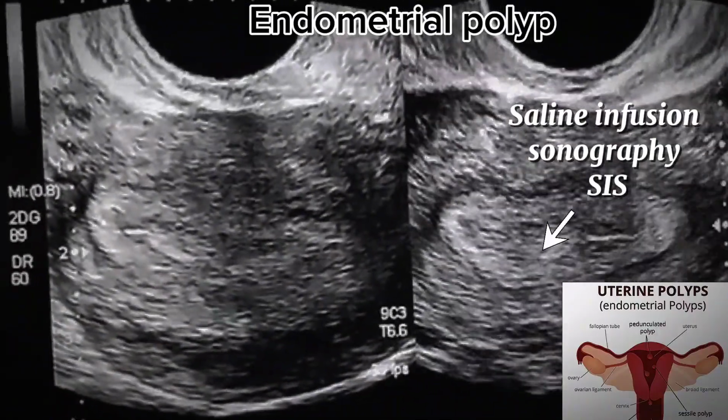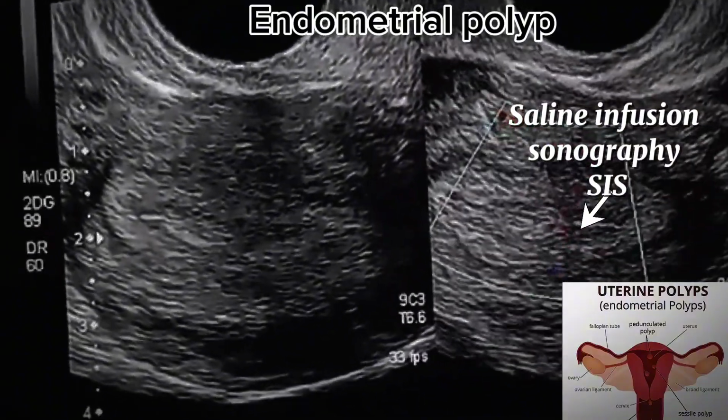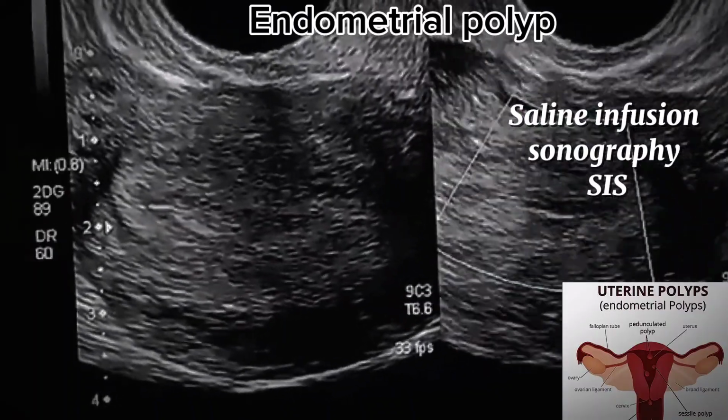Saline infusion sonography may be used to provide better contrast and visualization for polyp to be seen as a filling defect within the fluid distended endometrial cavity.